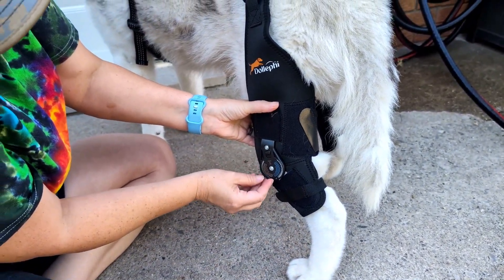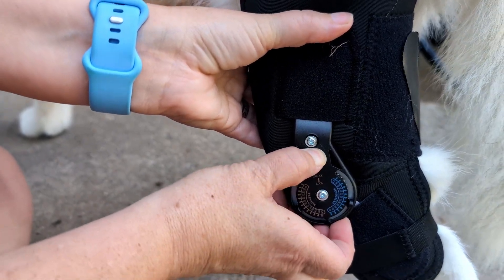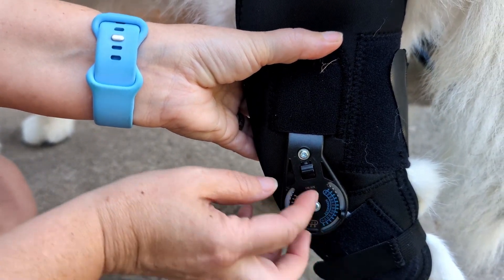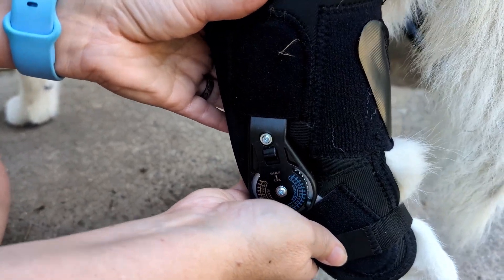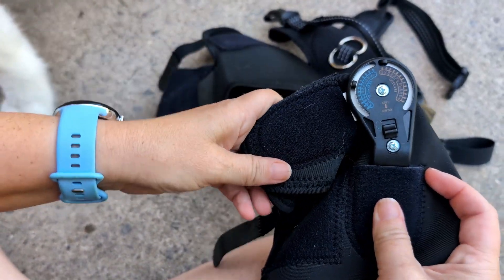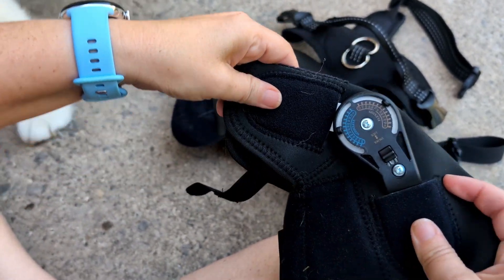You can see here, this is the dial of the knee part. You can lock it in place to allow limited movement, or you can keep it unlocked for full movement, just depending on what your dog needs at the time. This is actually a really cool feature — this is an adjustable hinge stabilizer. And you can set it differently for each side as well.